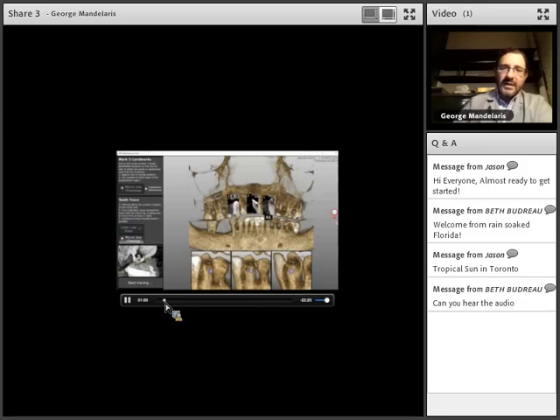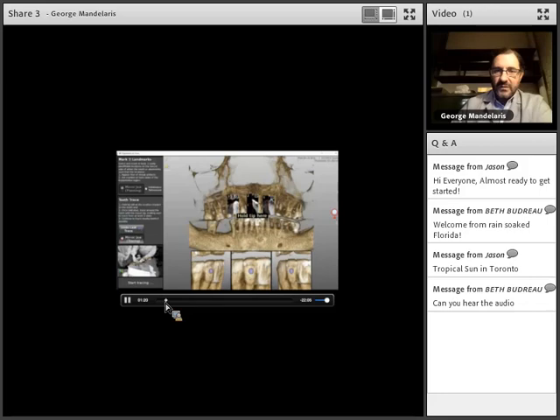Once that's complete, she'll then go ahead and move to tooth number 2, and then she'll move to tooth number 3. You'll kind of hear almost like a video game sound, like you're at the next level, and it'll take you back to the next phase, the next stage, to then do an accuracy check and move to calibrating your drill tip. So here's Sylvia basically doing the second tooth.